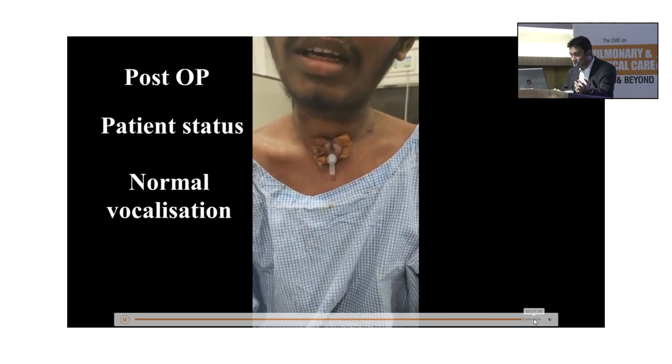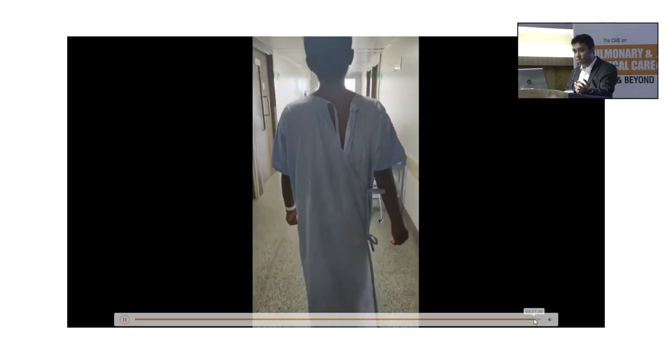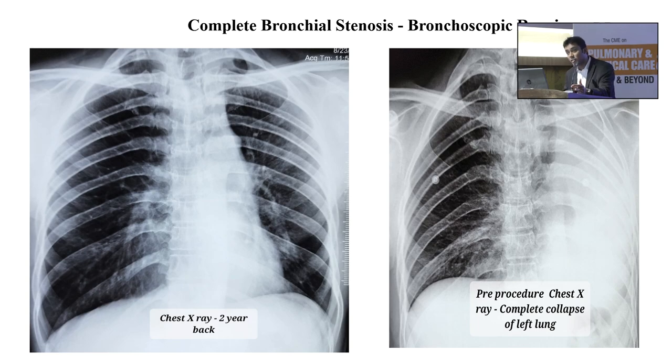the very next day. So in certain cases of post-intubation and post-tracheostomy stenosis, your bronchoscopy can help in cases where surgery cannot be performed or patient is not willing for a surgery. So this is another very interesting case which I wanted to show to all the residents here, because this is something which you will face as a pulmonologist day in and day out.